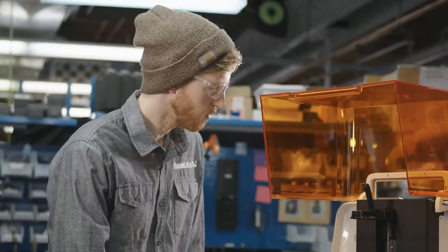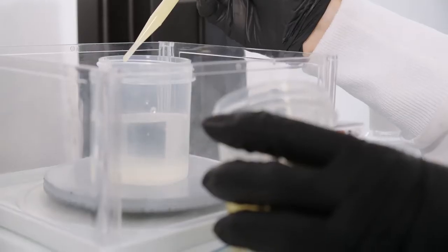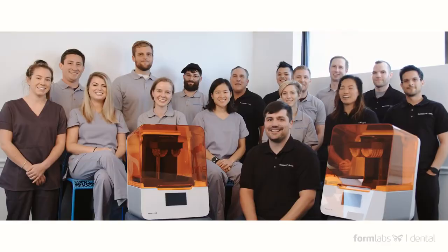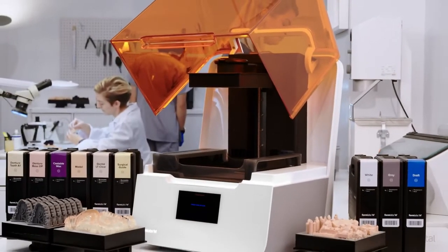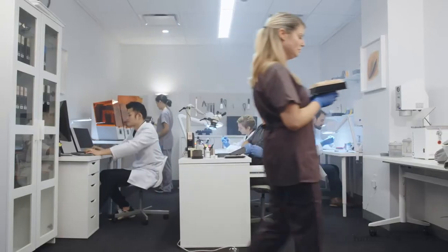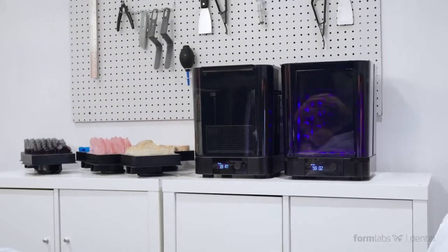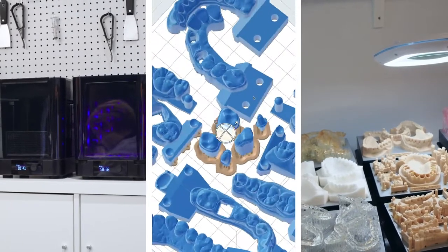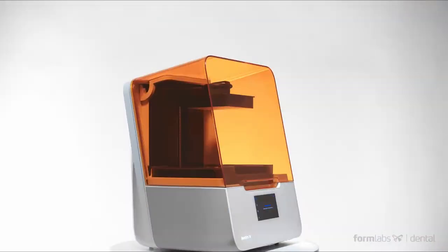Formlabs' dental product development is backed by an industry-leading engineering team, a state-of-the-art facility for biocompatible materials development, and a team of dental industry experts. With our years of experience as the leaders in desktop digital fabrication for dental laboratories all over the world, you can trust that Formlabs' hardware, software, and materials are tried and tested from start to finish to deliver the best clinical outcomes.